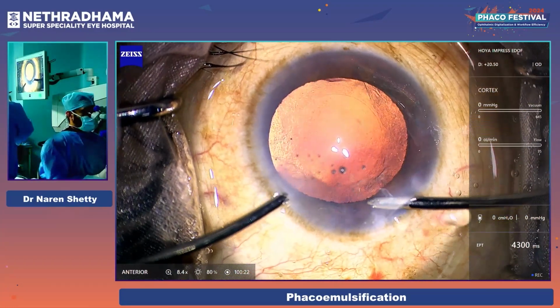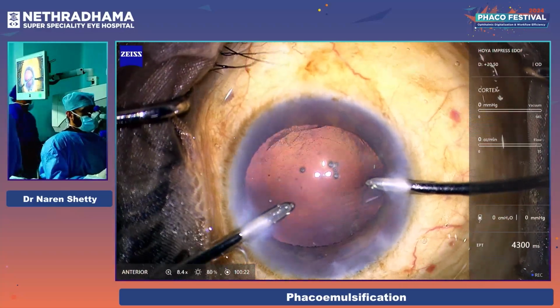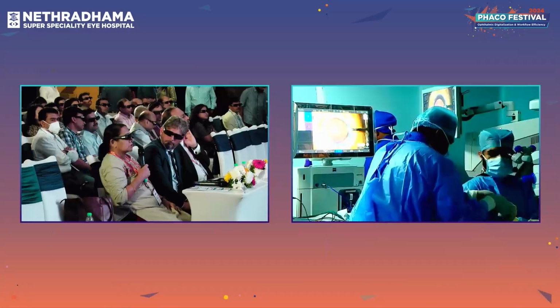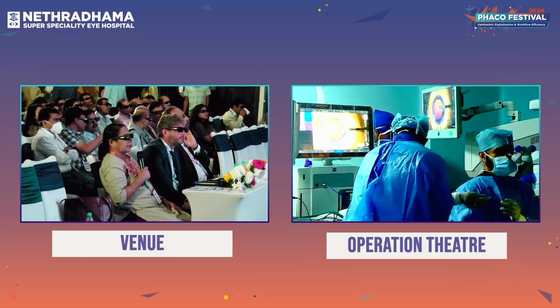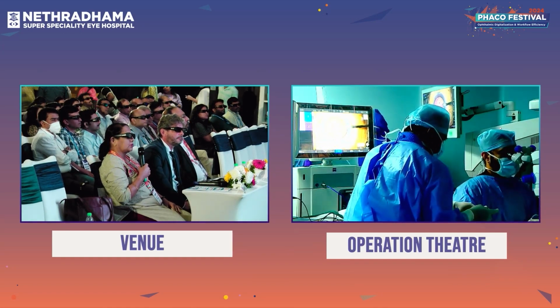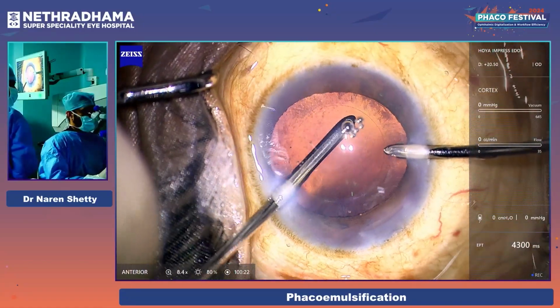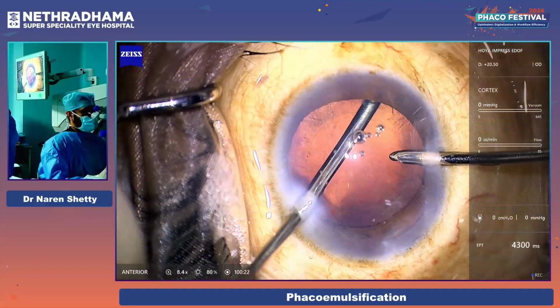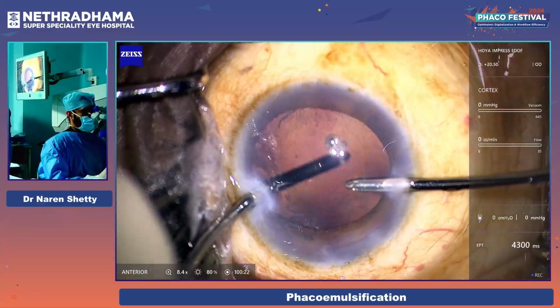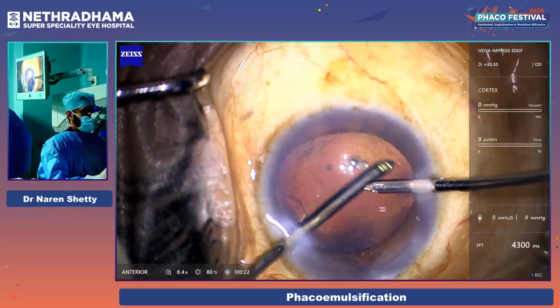So I usually use a bimanual one. You can just fill the chamber through the main port. Once that is done, aspiration cannula. Yes, ma'am. That is the irrigation cannula. You have used only the HPMC? Yeah, HPMC, ma'am. Though it was a hard cataract. So for chopping the pieces, you don't need to do anything else. Only after I have finished chopping, what I have done is, look at the light, sir. So what I've done is IOP 70.